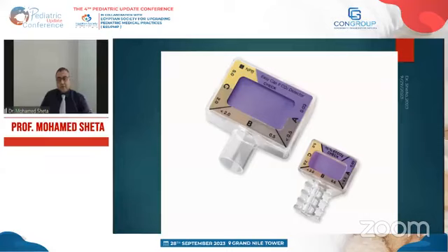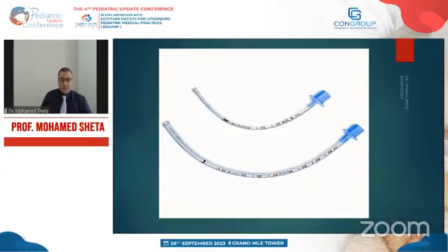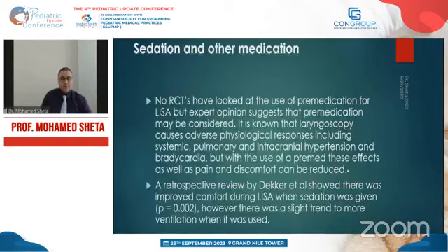In other institutes, they are not using this and they are giving surfactant directly because you can actually see the view of the larynx and it's very clear to insert the catheter through the larynx, and you'll be sure that it's inside. Whether to confirm by CO2 detector or not depends on the institute and the guidelines, which can change from place to place. These are the ET tubes. Of course, we can take this tab, which is the ET tube tab, and connect it with the catheter, and connect with the CO2 detector if needed.